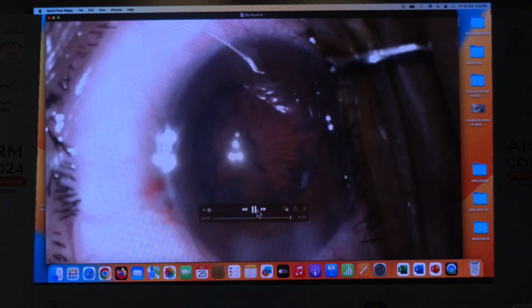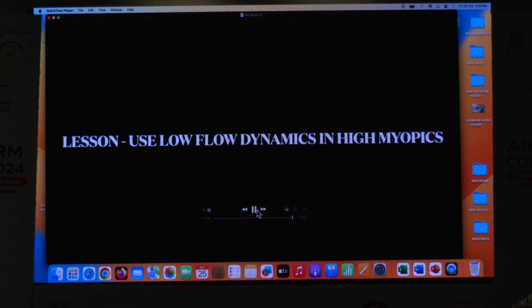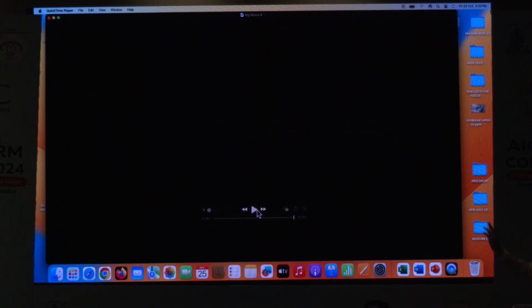And see this, the only thing is all the fluid dynamics should be low, like madam has said very rightly. If those are low fluid dynamics, then it is possible to tackle such a situation, and if not, then, yes madam.